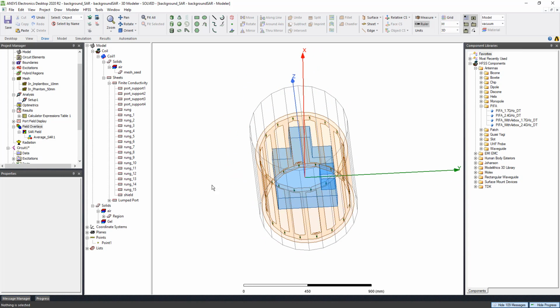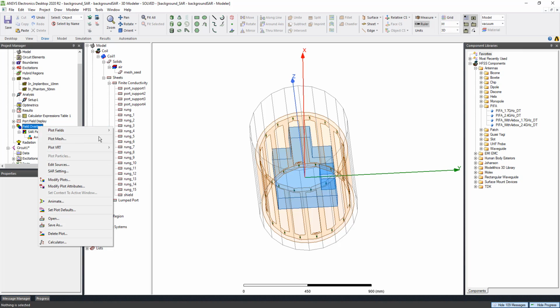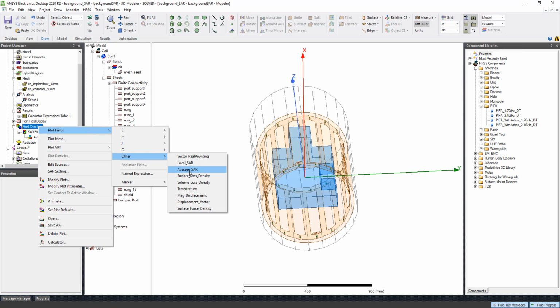specific absorption rate. In HFSS, there are two types of specific absorption rate that you can plot. One is called the local SAR. I can show you, it's right here when you plot field: there's local and average. When you calculate the local SAR, HFSS uses the equation at each mesh point to calculate the SAR on an overlay plot, and HFSS interpolates the value between the mesh points across the plot. So in this case, you can think of it as plotting the SAR value on the surface.